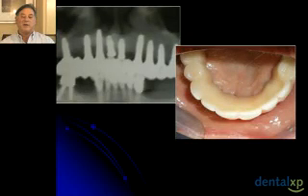The other thing that's interesting about this case, if you look at the 2 central incisor implants, neither of them are loaded. The reason for that is I was not pleased with the primary stability of those implants when I placed them. So I informed my teammates that let's do the provisional restoration. We'll let those implants heal in an unloaded way, and then we're ready for the final case. We'll bring them into the restoration.